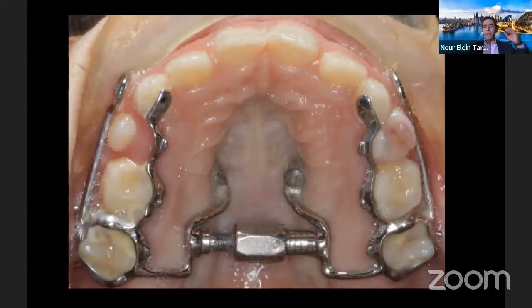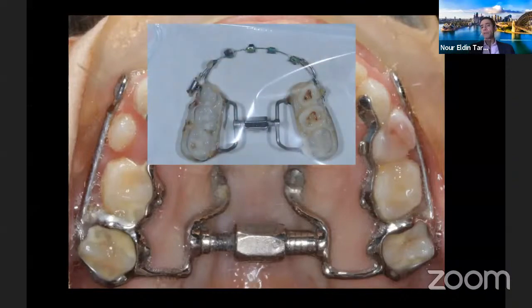Now see what's happened here: the Ds actually shed in the middle of treatment. And that will tell you that if this appliance was a tooth-borne appliance, there would be hardly any skeletal expansion in that area. So if we didn't have TADs, we would be mostly extracting teeth with the appliance, even though they seem to have enough root. So that's why you see things like that. And you don't really get a lot of expansion when this has happened.